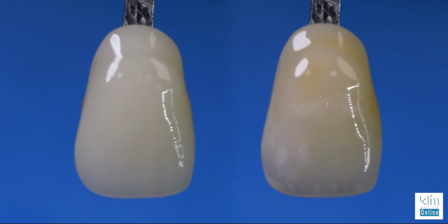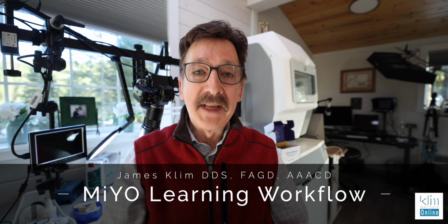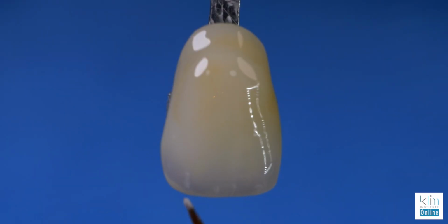I tell you, they say that practice makes perfect. And that's what I like about this video. It's an exercise in taking a shade tab and modifying that shade tab with MiYO. We're not going to fire it though, but we're going to modify the shade tab with MiYO so we can get different types of effects.